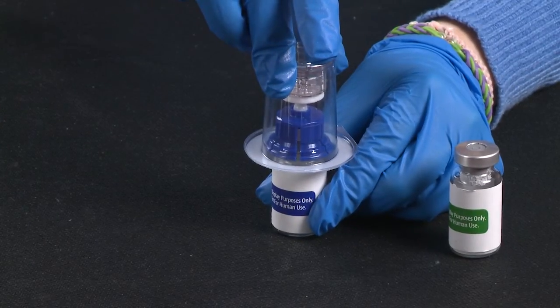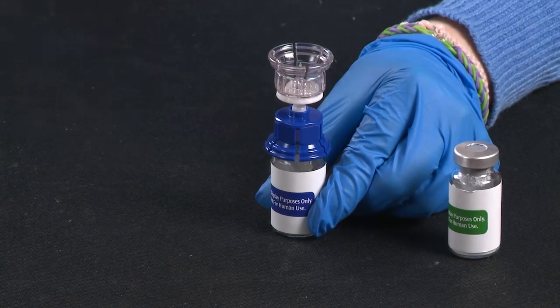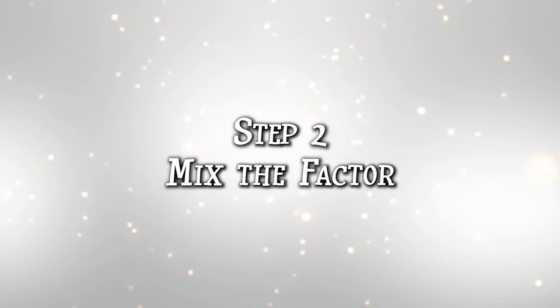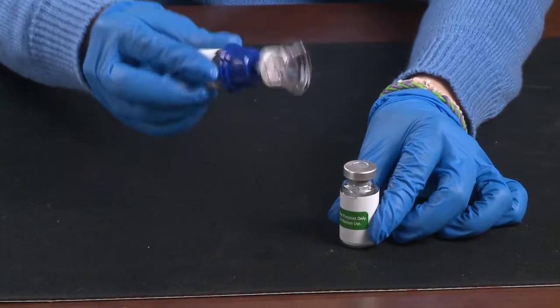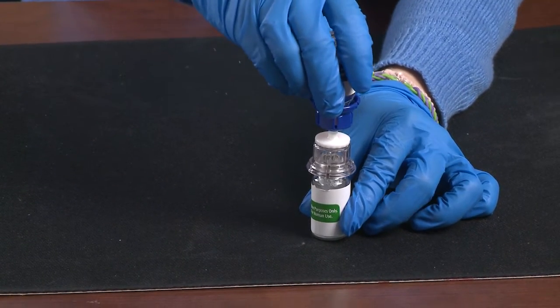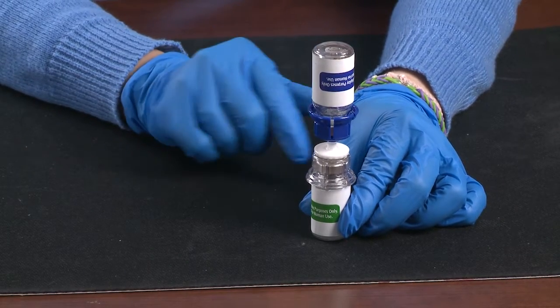Now, take the device out of the package by lifting the plastic cover off. Do not touch the top of the device. Leave the factor on a flat surface. Turn the Mix 2 vial upside down and push the white tip into the product. Make sure it goes in all the way. The liquid will go in automatically.